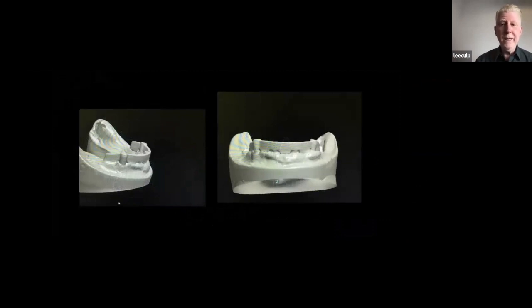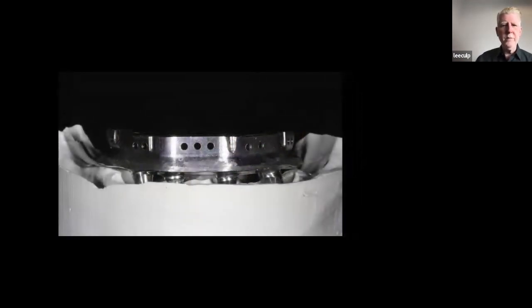This is actually the first case that I ever did, maybe about 8 years ago, right as digital dentures were just starting. Avident was coming out. Everybody was kind of talking digital dentures. But we had a hybrid in the laboratory, and they were fixing to take all the teeth off, put all the teeth back on, process it, and do it again. And I said, no, just give me the case. So we just scanned the bar in on the model, and it looked like that. It was just an existing. We cleaned it up and then scanned the bar on the model.